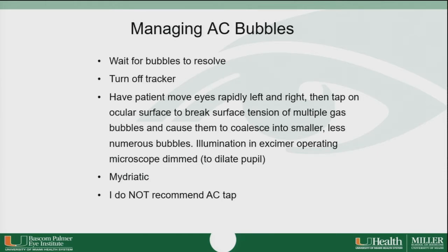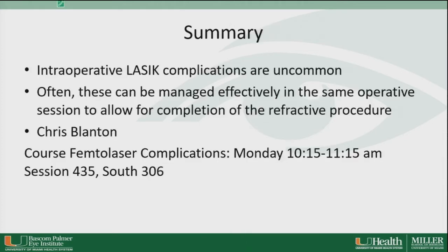You can use mydriatics, but be aware that sometimes as the pupil dilates, the center of the pupil will change. So when I use mydriatics, I try to use a gentle mydriatic and be ready to fire the excimer laser as soon as the pupil gets large enough that I can track. I do not recommend AC taps to remove AC bubbles.